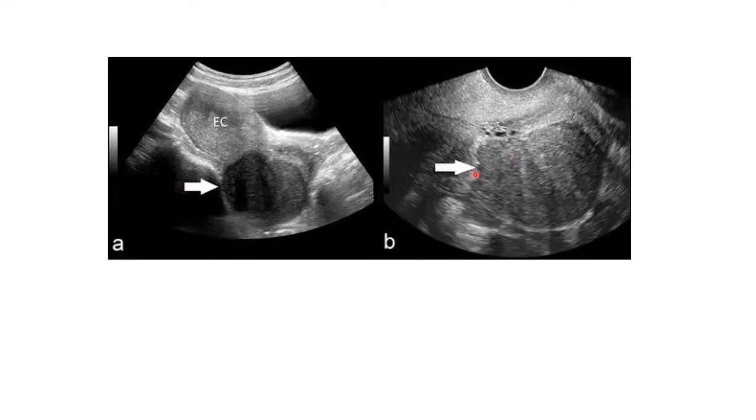So here you can see this is a fibroid that is existing in isolation. So this one is a parasitic myoma, or a wandering fibroid. You can see these even up closer to the kidneys, or in the rest of the stomach you can see this type of fibroids.